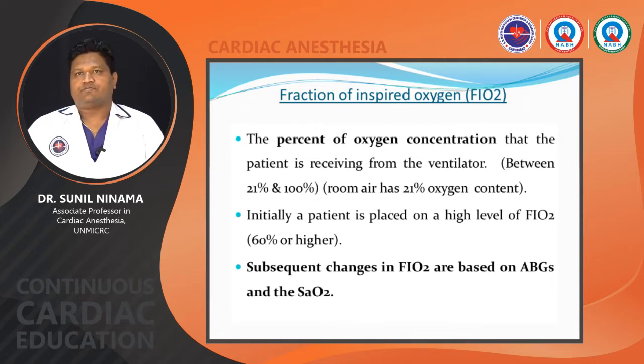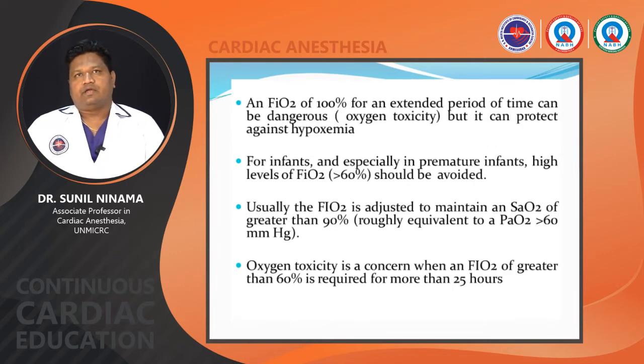Subsequently, the changes in FiO2 are based on your ABG or SpO2. An FiO2 of 100% for an extended period of time can be dangerous, but it can protect against hypoxemia. For infants or children, especially premature infants, high levels of FiO2 should be avoided because it may cause oxygen toxicity. That's why it is avoided.